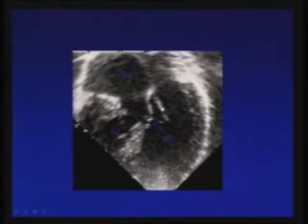Here in this 4-chamber view, the information I am getting is the AV concordant, but this valve is attached. This is the interventricular septum. This is a left ventricle, morphological, it is smooth. This is right ventricle. This AV valve, which is tricuspid, is attached towards the left side of the interventricular septum. There is a large inlet VSD and it is attached, meaning straddling grade 1 to 2 is occurring here. Straddling grade 2 is if it is more than 1 centimeter. If it is attached at the septal tip, it is straddling grade 1.